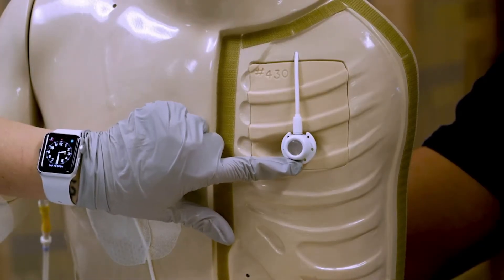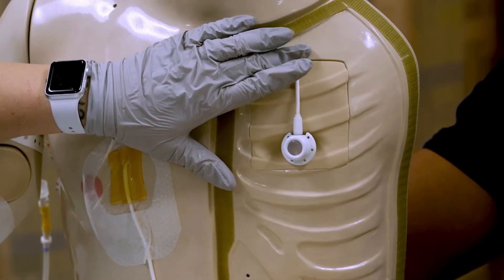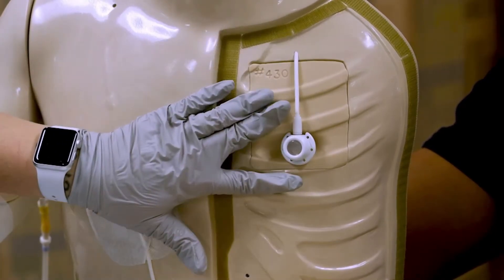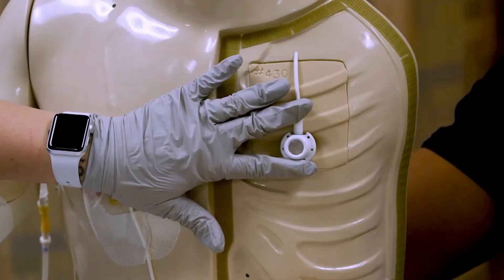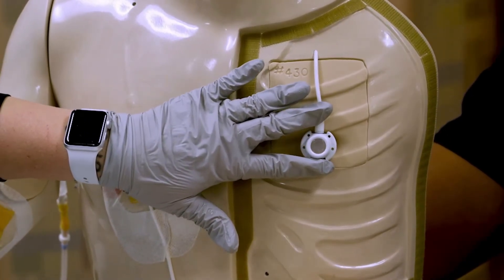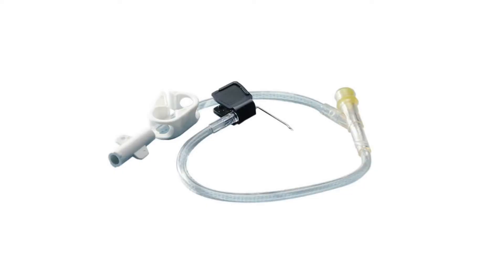So this is our port-a-cath, and this is the line that actually goes into the subclavian. What I have here is a little rubber port, and that's where we stick the Huber needle. It is a 90-degree needle, so this is going to lay flush against the skin.